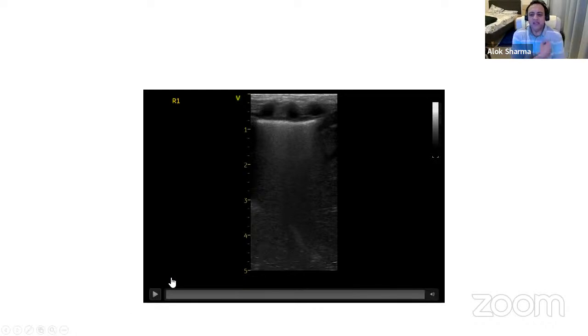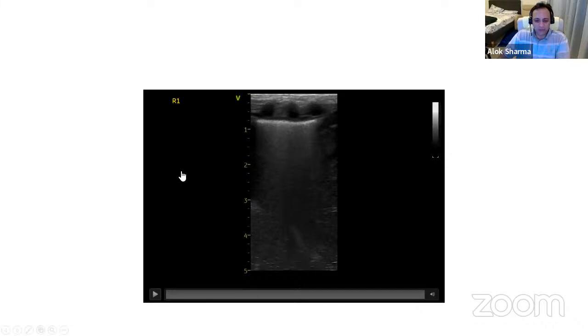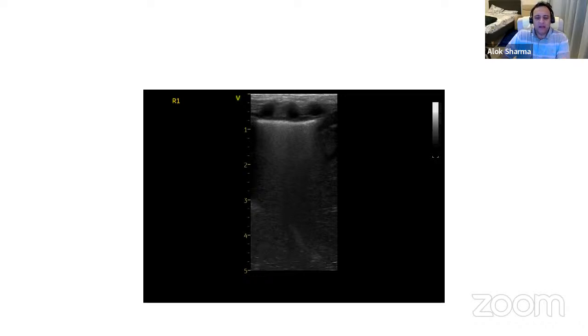So what I would say is that as far as possible, guys, and this is obviously, we're starting our second month now, when you save your images, and I'll show you in my images today, you can actually save the settings of your frequency on the image without having patient identifiable details. Because my gut feeling is your gain could go up. And I think if your gain went up, you would see B profiles and A lines much better. So a little bit of a higher gain.